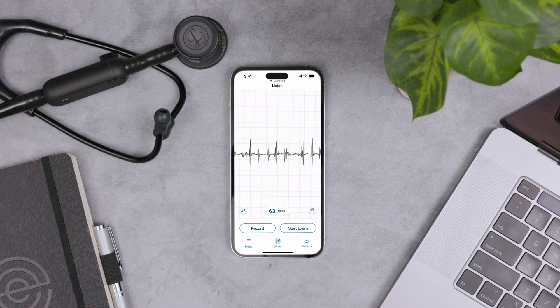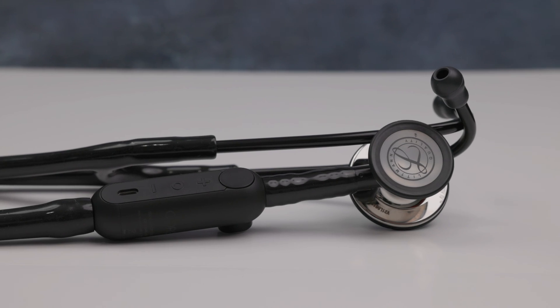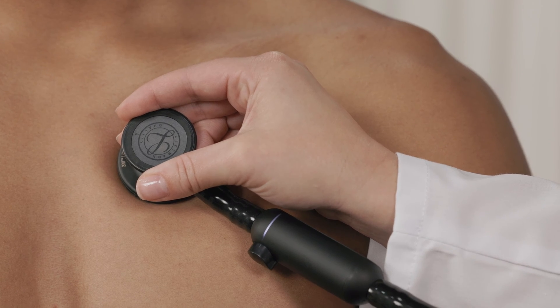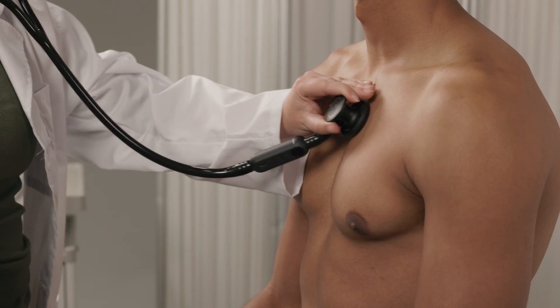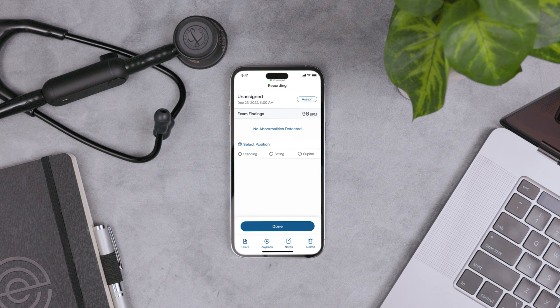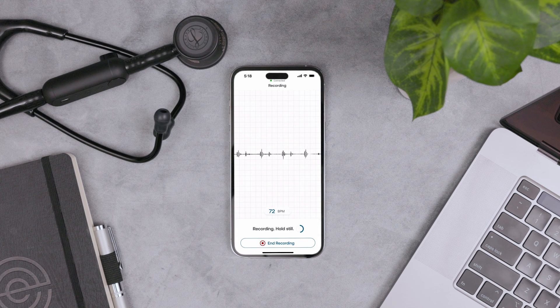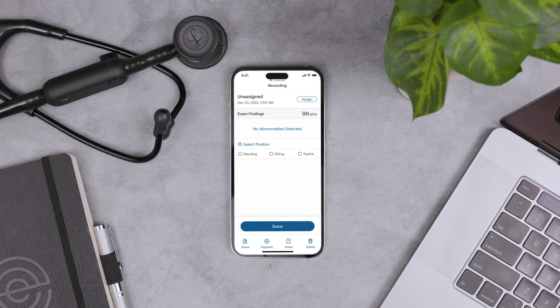Hey there! In this video tutorial, we're going to show you how to get started with the Echo app. You'll need to use the app to finish setting up your Core attachment or 3M Littmann Core digital stethoscope. The app is required to take recordings directly from the Echo device. You'll also need it to visualize the phonocardiogram or PCG — a waveform of heart sounds. We'll show you how to create an Echo account, connect the Core with the app, and give you a tour of the main features. Let's get started.